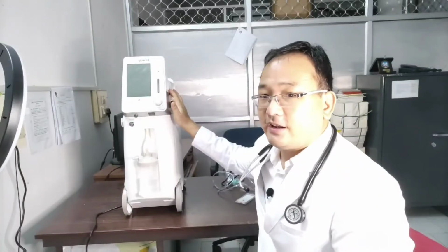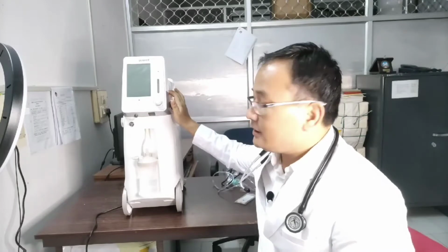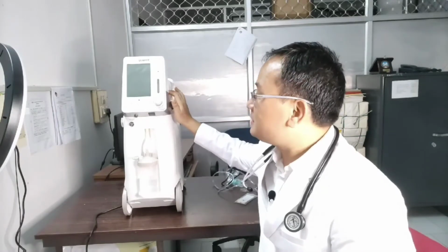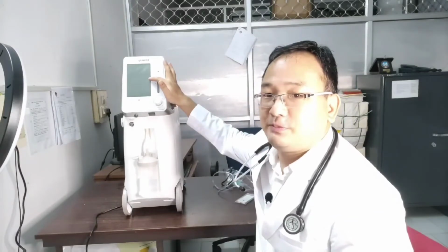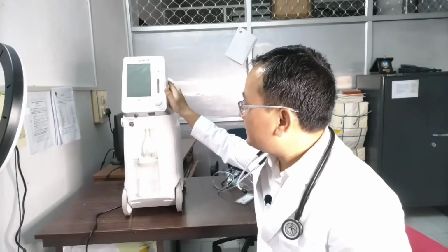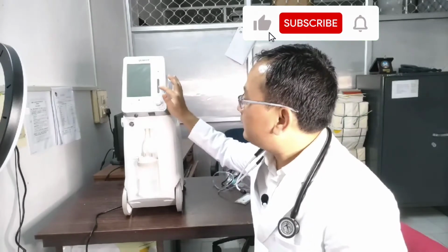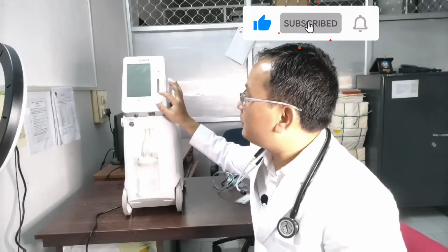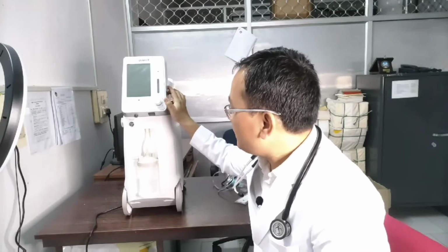This is an oxygen concentrator machine. In this oxygen concentrator machine, this is the monitor which displays the pulse rate and oxygen saturation. This is the knob with which you can regulate the oxygen flow per minute. This is up to 5 liters per minute.